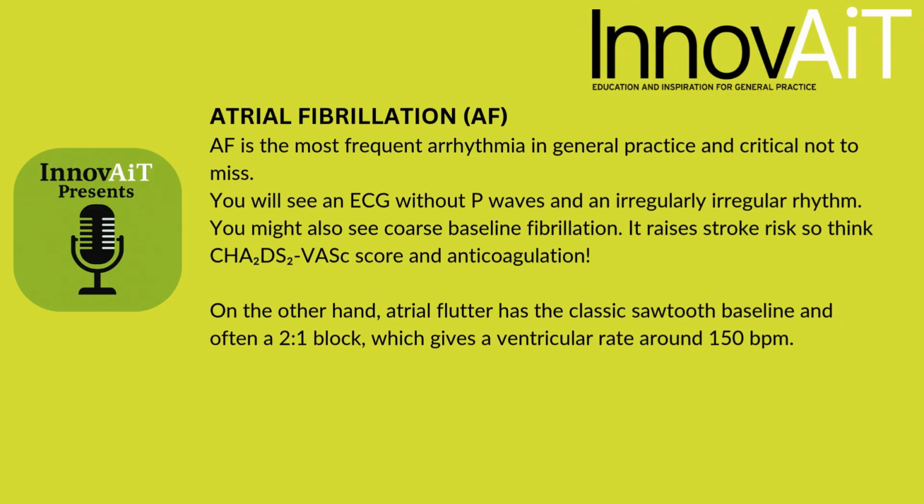Atrial fibrillation is the most frequent arrhythmia in general practice and critical not to miss. You will see an ECG with absent P waves and irregular rhythm. You might also see a fibrillating baseline.